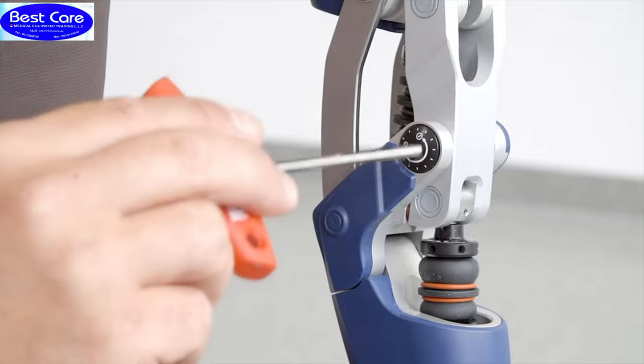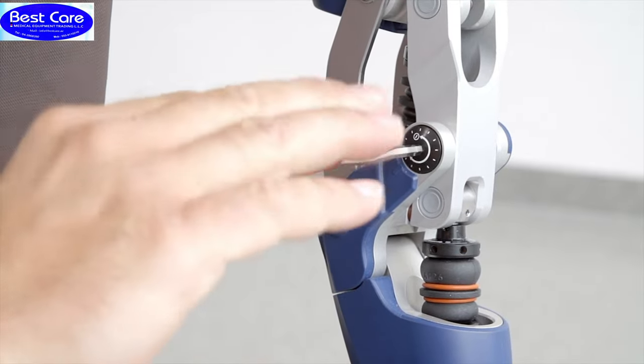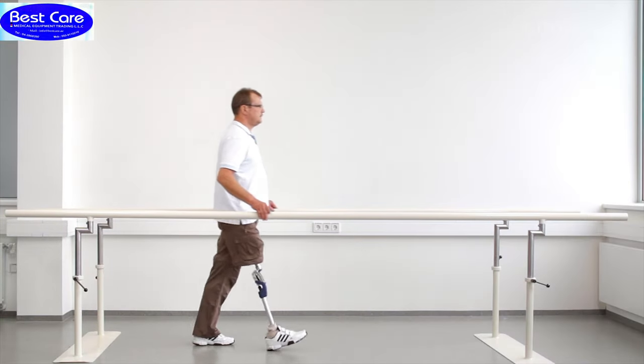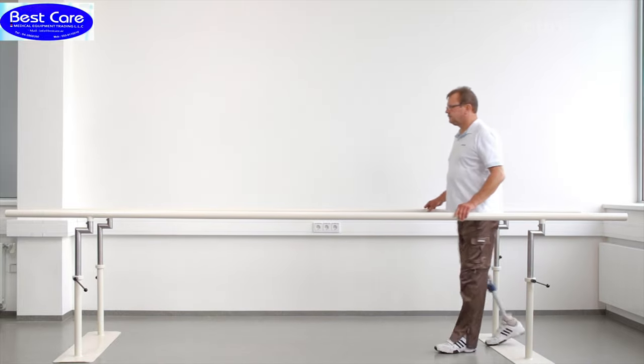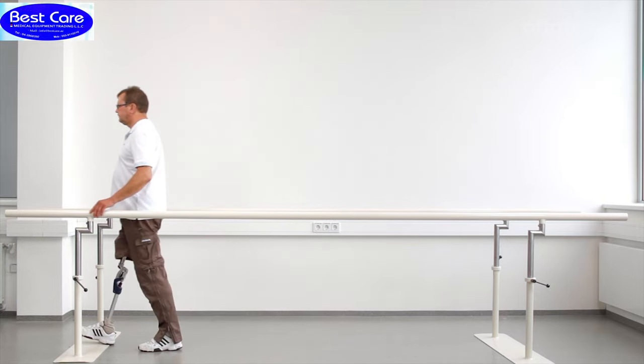When adjusting the swing phase, remember that the extension assist and swing phase friction influence each other. Please ensure that swing phase friction is increased only in small increments. Otherwise, the knee joint may not reach full extension due to the high friction at the axis, and heel strike will occur with a flexed knee. This can be an unsafe situation for the user.